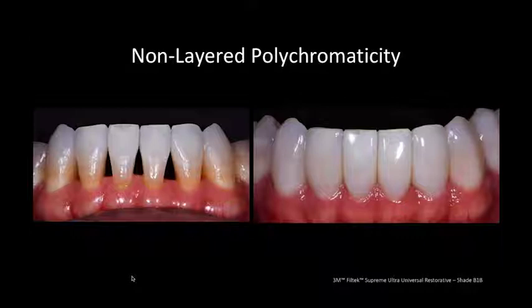Now, we talked about whether or not I should allow some of the underlying coloration to come through. And what we decided on ultimately was to allow just a tiny bit of the amber coloration to come through, just to provide a little bit of warmth to a relatively high value cool color.